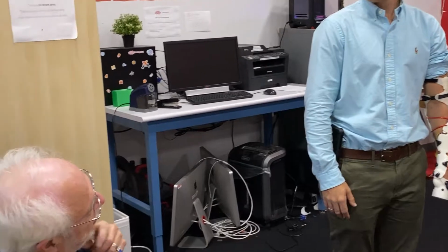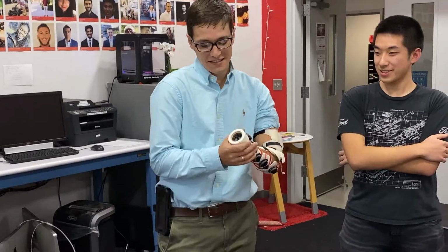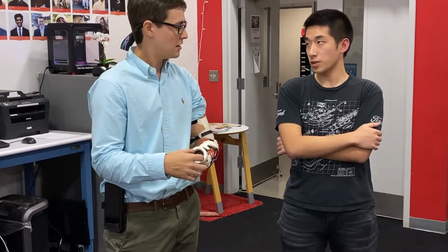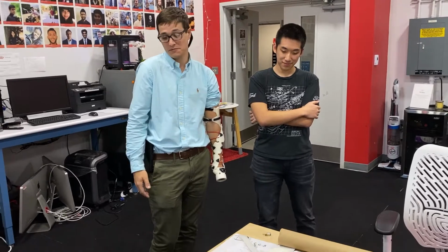But do you have an attachment so that if Eric Luber shows up with his motorized gripper this weekend? So I found this DWG file. It's on Autodesk somewhere for the iLimb bionic hand. I found that, so you can print that.